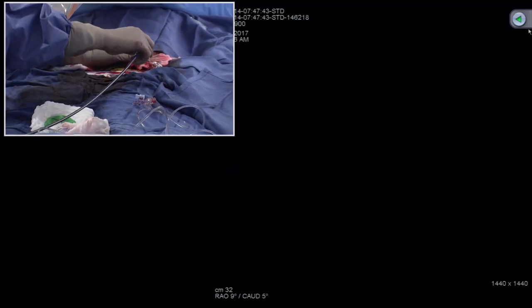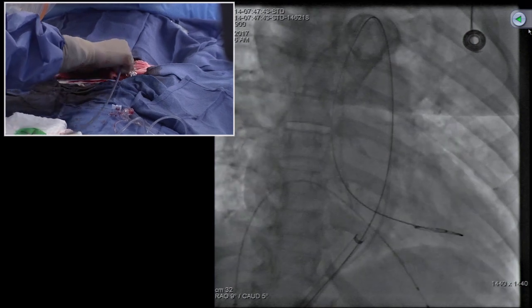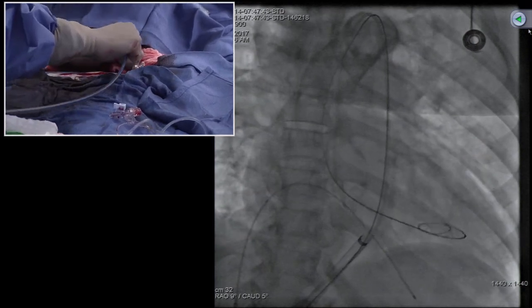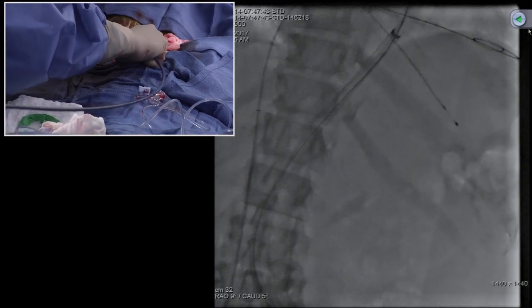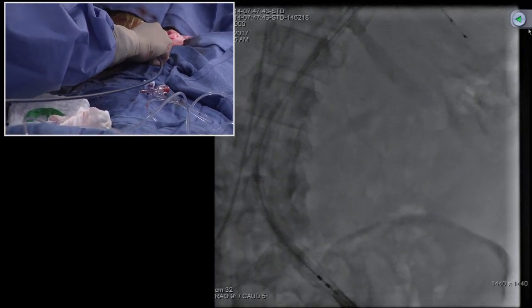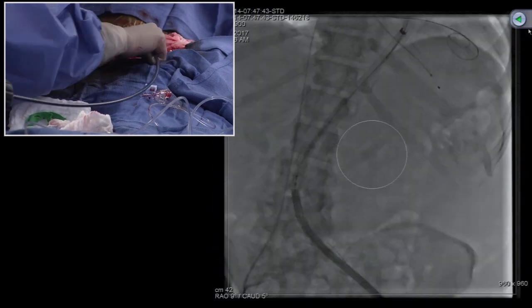We're going to see how easy or not so easy this is. This is the loader catheter. I'm going in. You want to go below? Yeah. See if it goes. Yeah, just always keep an eye on the wire, though. That's the first spot in the LV. It's gone. We're okay. We'll be okay now.